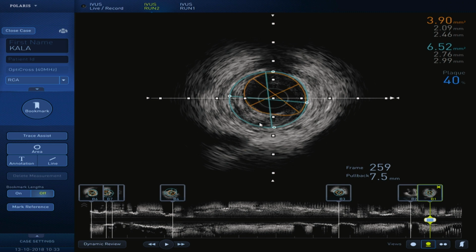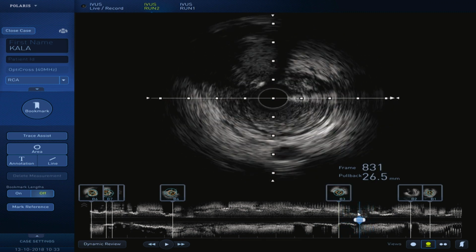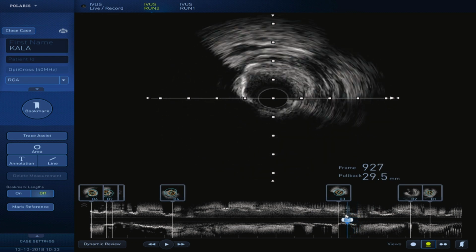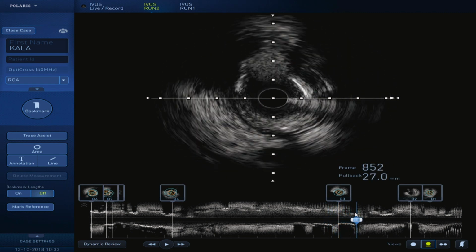I think distally, yeah, it absolutely did grow a bit after the ballooning. And can we just look at the bifurcation? We're coming a bit proximal to the bifurcation. The bifurcation's calcified as well. Yes, absolutely.